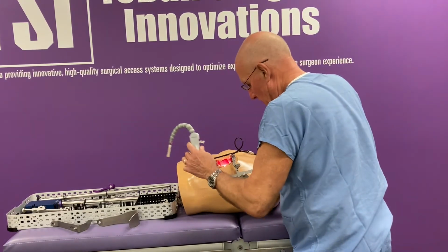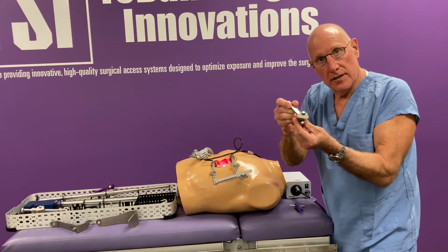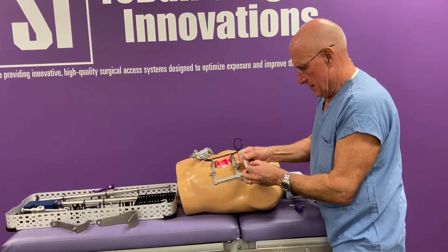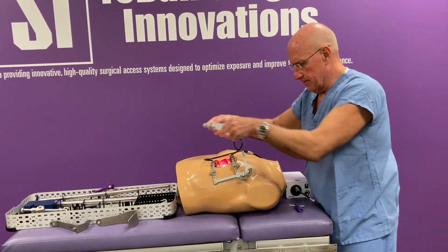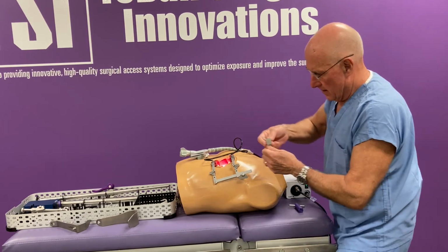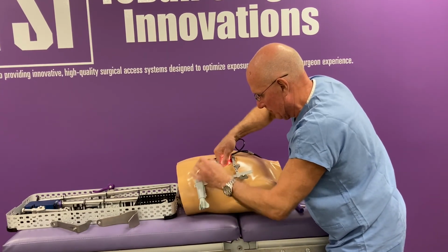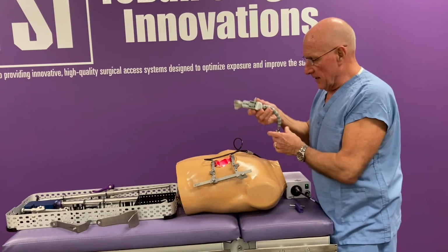Okay? Now, we can either mount it on the rack like this, but the preference is usually to take this rack extension. This gives us several options for mounting the stabilizer. So one option is to mount it right here, like this. Okay. And then we can mount the stabilizer here and enter the incision. Or we can also mount it, depending on how the anastomosis target's lining up, over here, put the stabilizer on the rack extension, and come in this way, approach it from this direction. Okay? So you have this rack extension, which gives you multiple options for mounting your stabilizer.